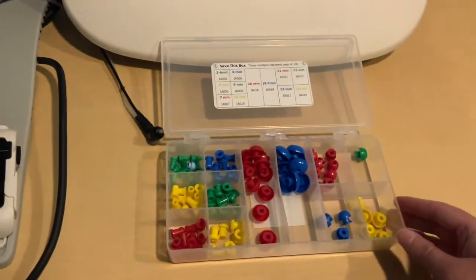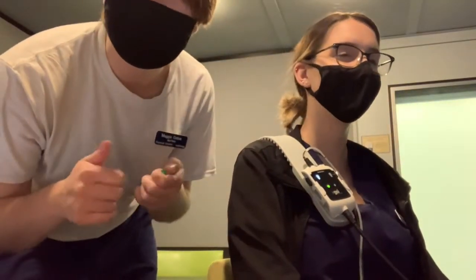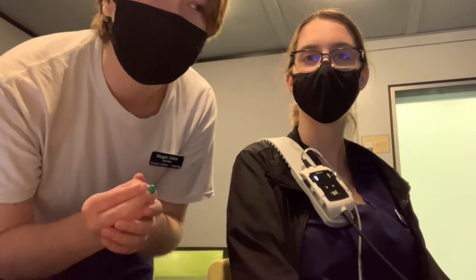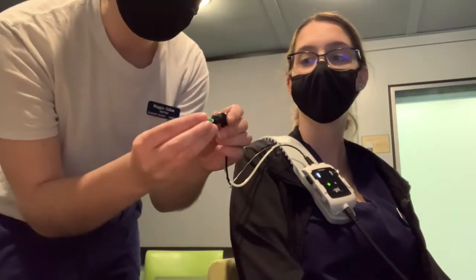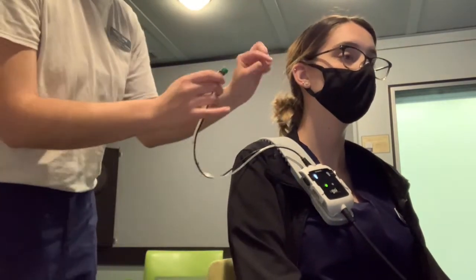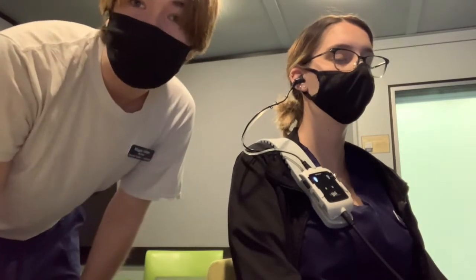And here are different probe sizes. So we're gonna put one of those inside Emily's ear and test her tympanogram. After looking inside Emily's ear and it's all clear, I'm deciding I'm going to use this size, and it'll vary depending on the size of your client's ear canal, but I'm going to go with this one and see how it works. I'm first going to attach it here and place it on the end, make sure it's nice and snug. And then same as otoscopy, I'm going to pull up and back as I insert the probe into her ear. And we want to make sure there is an airtight seal so none of the sound or pressure leaks.